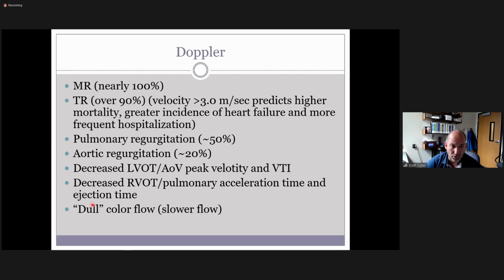A good tech is going to know when they've got everything that they need, and they're confident that they don't need to get anything better, and they can certainly do those measurements after the fact. But I just don't personally think it's a good training to do it after the fact, because you do come across stuff that you need to redo.